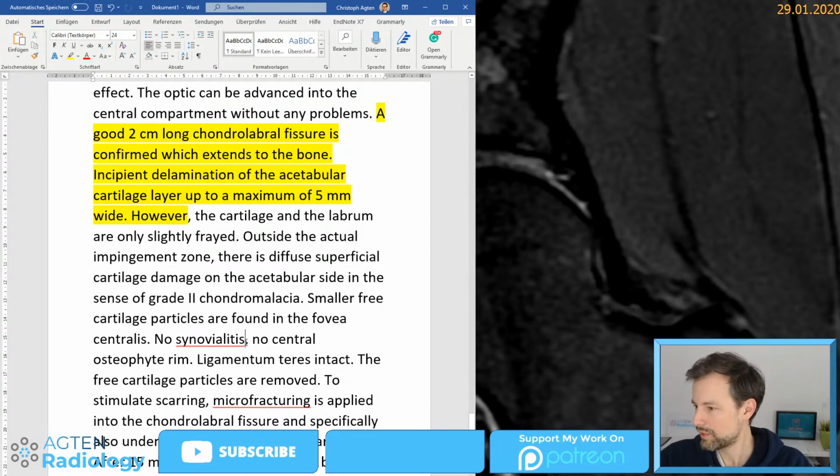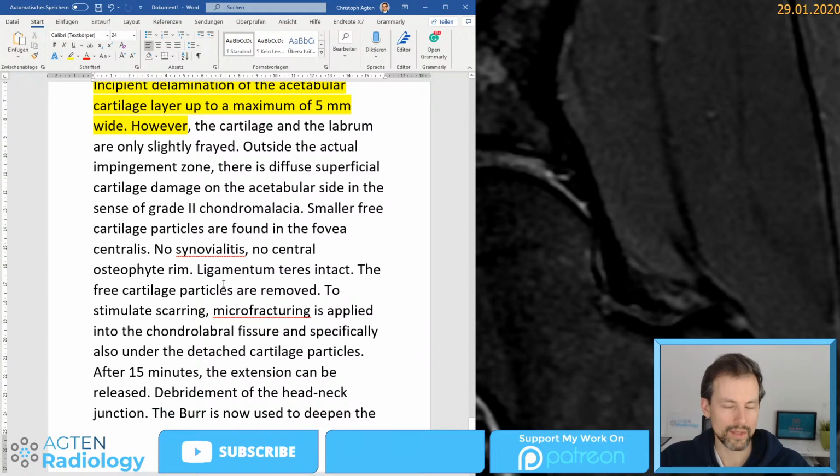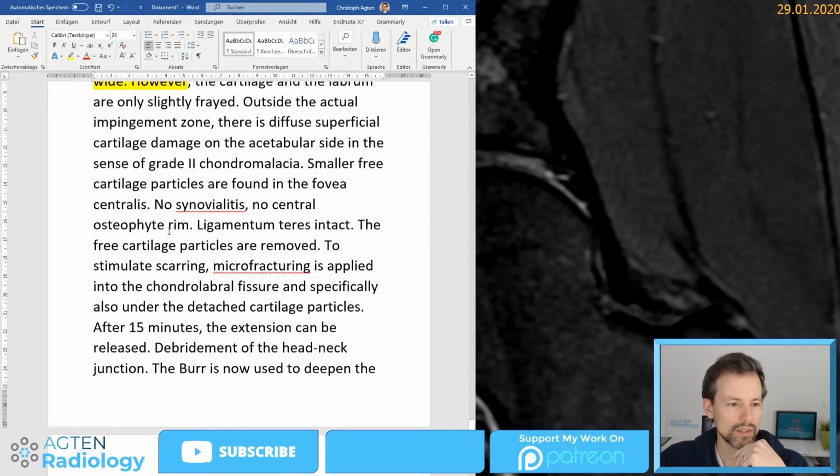Yeah, good question. Do you really believe everything they write in surgical reports? No, not always. I've seen shoulder arthroscopy reports where they reported the subscapularis, not the infraspinatus tendon, as completely normal, but it was completely torn, and there was just some capsule or some kind of lining covering the humeral head, which must have looked intact from inside the joint. But on MR it was so obvious that it was a complete tear and a completely retracted tendon. We can't really argue, and I unfortunately don't really understand the arthroscopy images. I can't really orientate there.